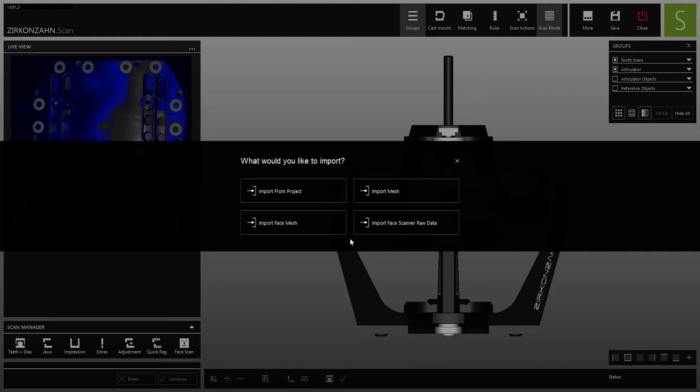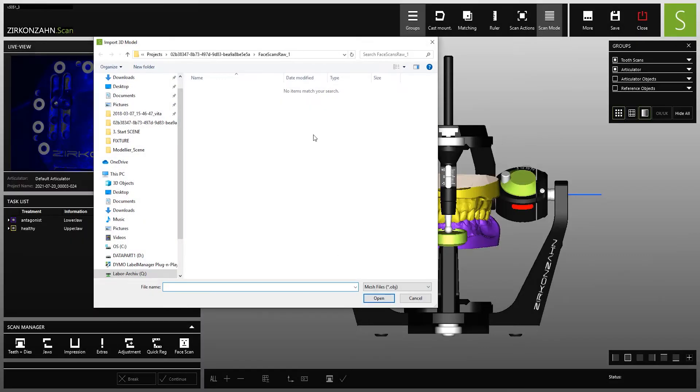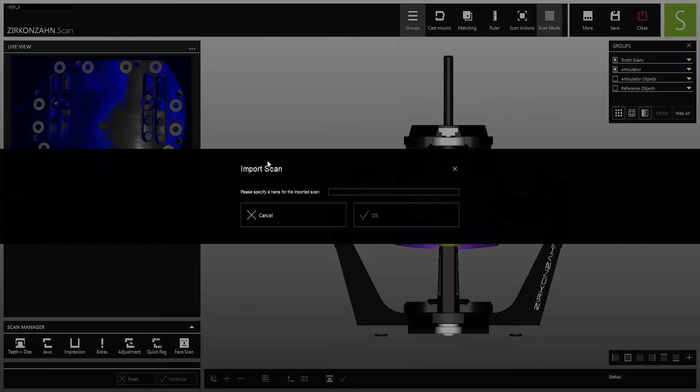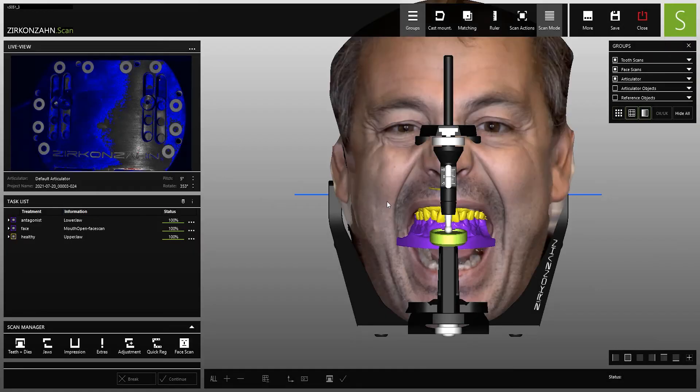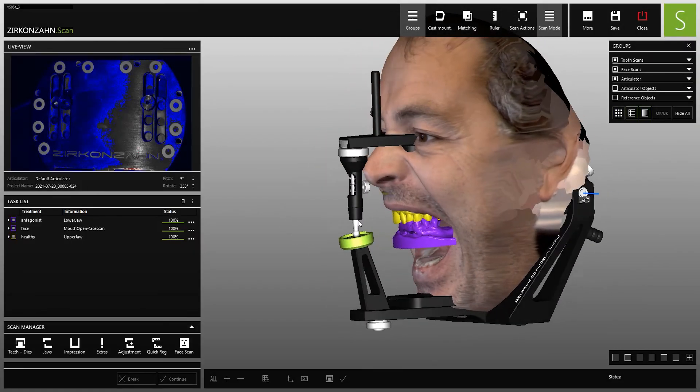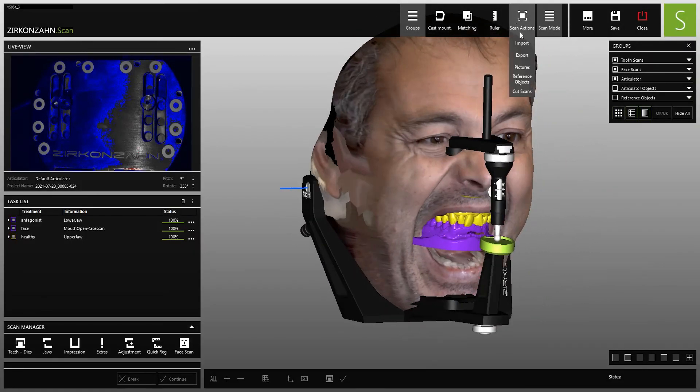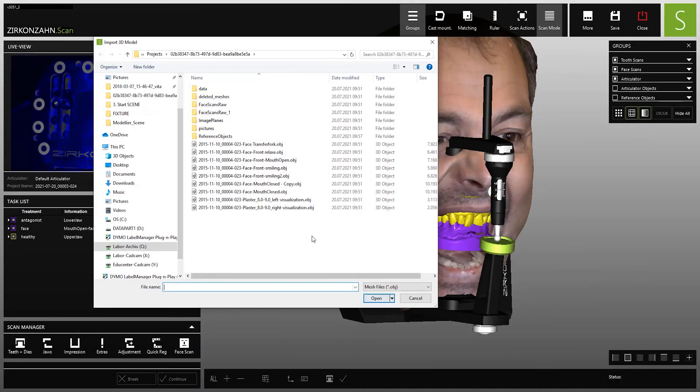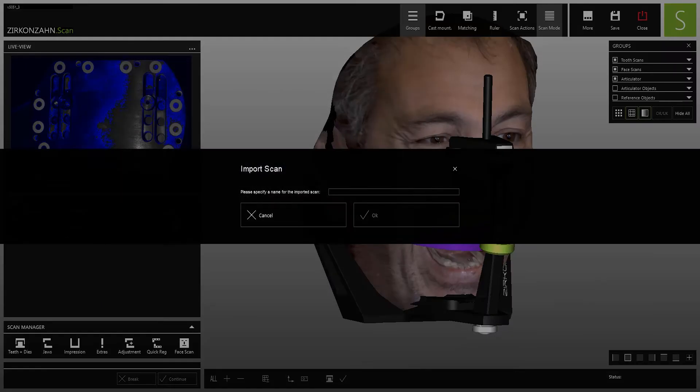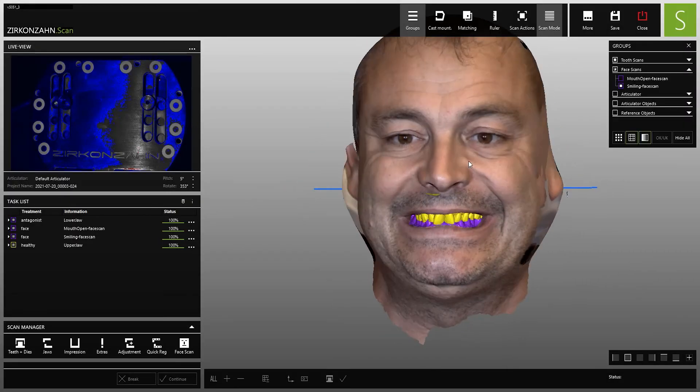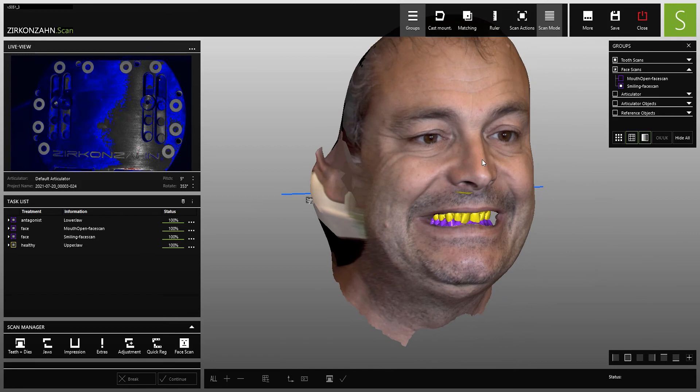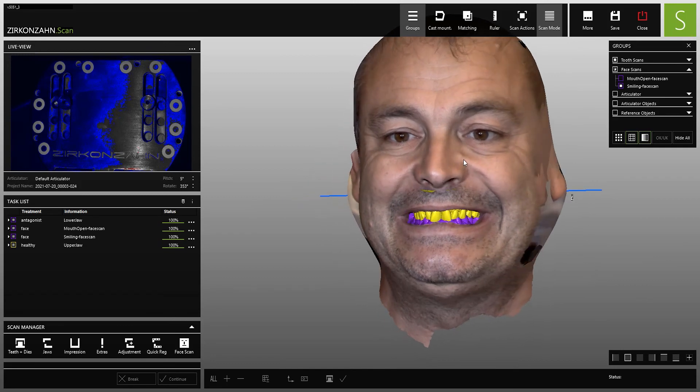For the production of aesthetic rehabilitations, it is also possible to import model and intraoral scans, as well as the 3D face scans taken with the Zirconzon Face Hunter. This and much more are available in the Zirconzon Scan software.